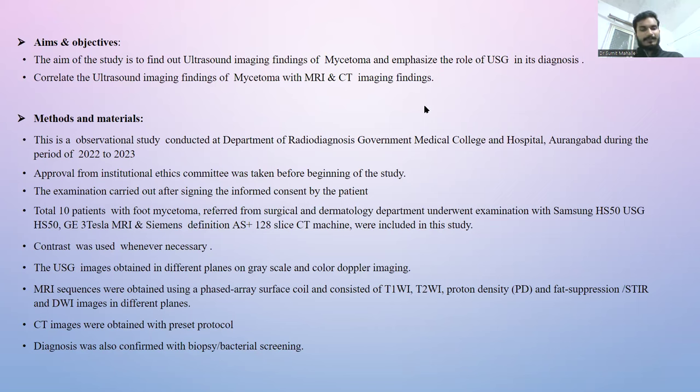Okay, so the methods and materials used here. This is an observational study conducted at the Department of Radiodiagnosis, Government Medical College, Aurangabad during a period of 2022 to 2023. Approval from the Institutional Ethics Committee was taken before beginning of the study. The examination was carried out after signing the informed consent by the patients. A total of 10 patients with foot mycetoma referred from the surgery and dermatology departments underwent examination with the Samsung HS50 USG machine, a GE 3 Tesla MRI machine, and Siemens Definition AS 128 slice CT scan machine. Contrast was used whenever necessary and with proper consent.